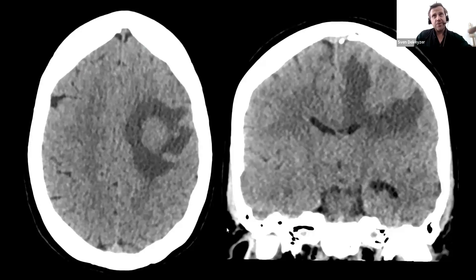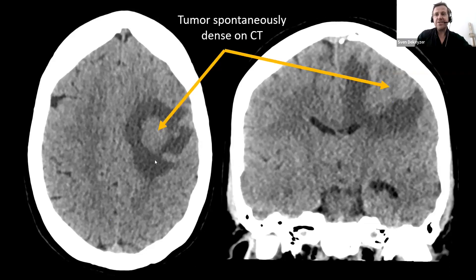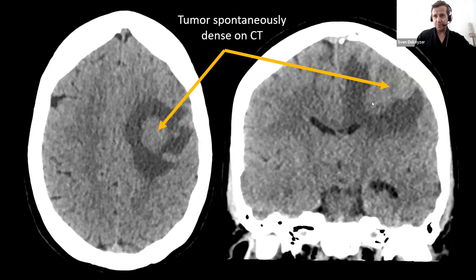What does a central nervous system lymphoma look like? On an unenhanced CT, we see a tumor that is isodense compared to the cerebral cortex, surrounded by hypodense edema. This increased density of the tumor is a very characteristic finding in CNS lymphoma — the density is exactly the same as the normal cerebral cortex.